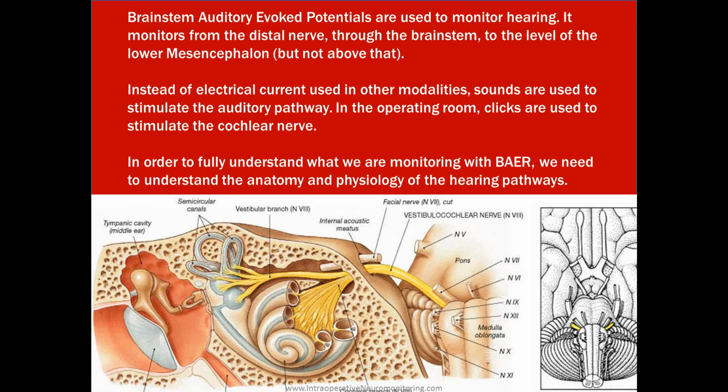Instead of electric current like we use for SSEPs and MEPs and other modalities, sounds are used to stimulate the auditory pathway. In the operating room, clicks are used to stimulate the cochlear nerve, and that's just because the click has a large spectrum of frequency, a long bandpass.